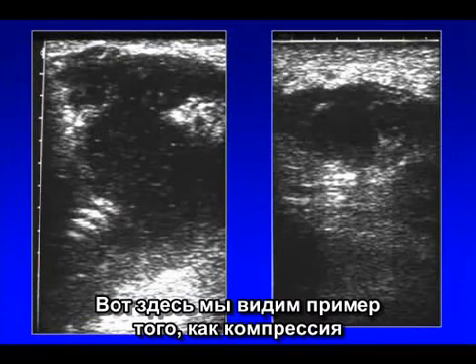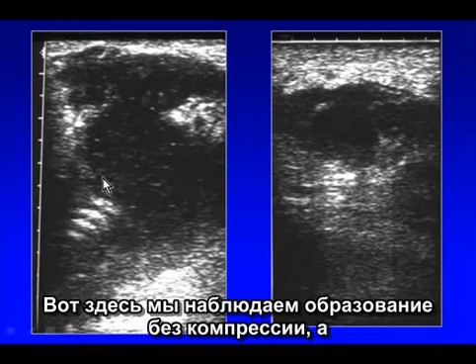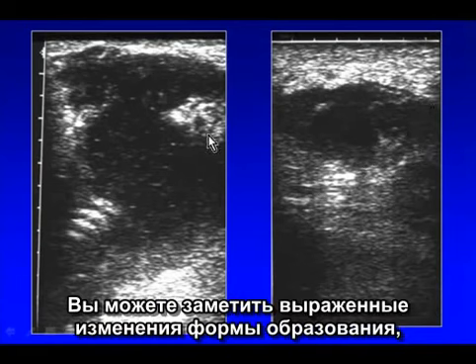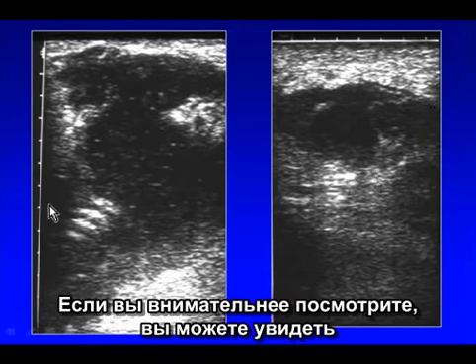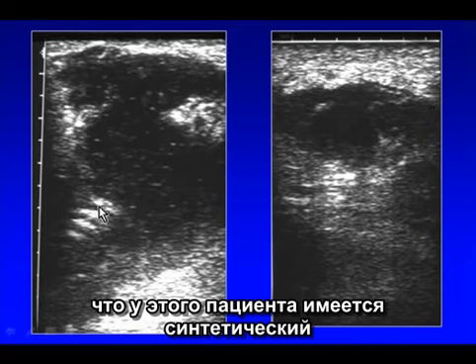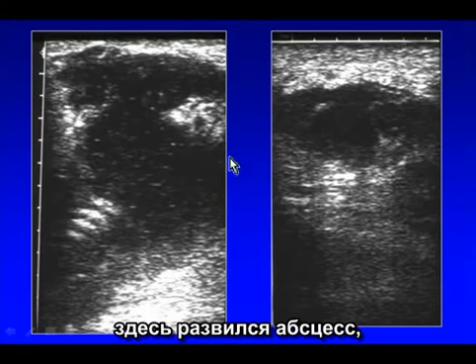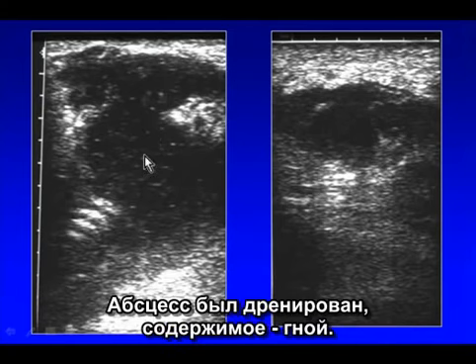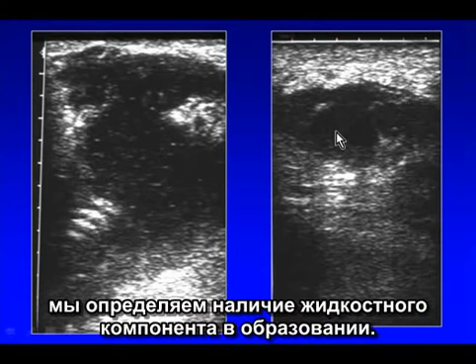Here's an example of how compression can give you an etiology of a lesion. This patient presented with a mass in the inguinal region, and this was the mass without compression, and here was the mass with compression. You can see that the marked change in the shape of the mass indicates that this is a fluid-containing mass. And if you look more carefully, you actually see that this patient had a failed femoral graft, and that is an abscess that has formed around this failed graft. You can see the internal echoes within this abscess, and we drained it out, and we got pus from this. But again, doing compression proves that it is in fact a fluid-containing structure.